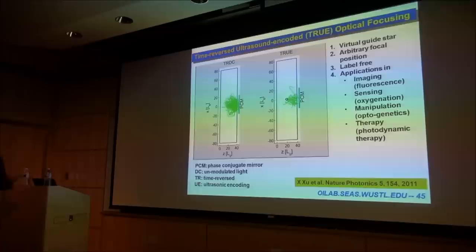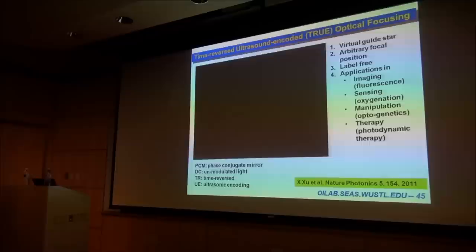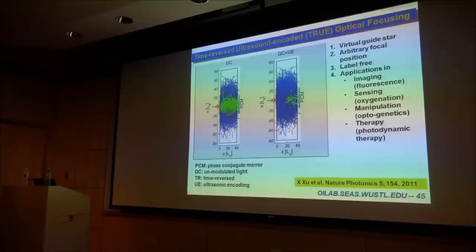So for the first time, we're able to focus relatively deeply in scattered biological tissue. Through this time reversal, we call this time reversed ultrasound encoded, or TRUE, optical focusing. And this has now become a very hot topic. Several groups are really moving this technology forward. It's great to see that.